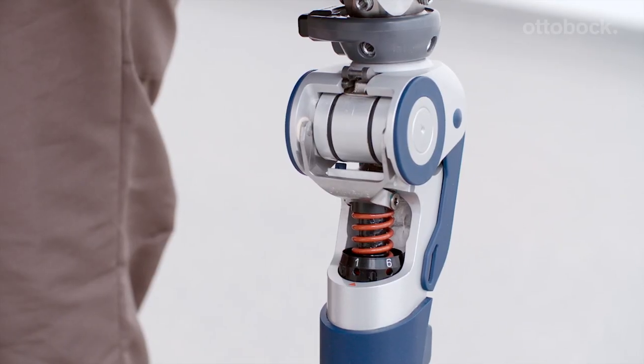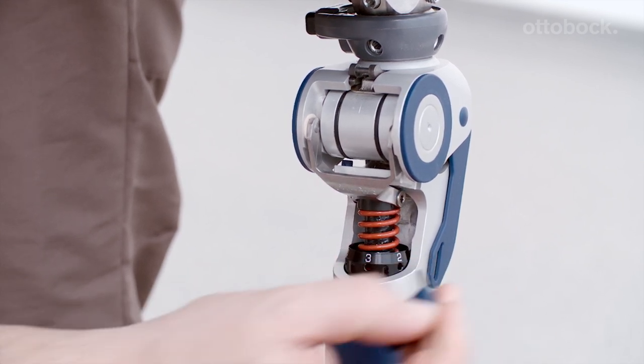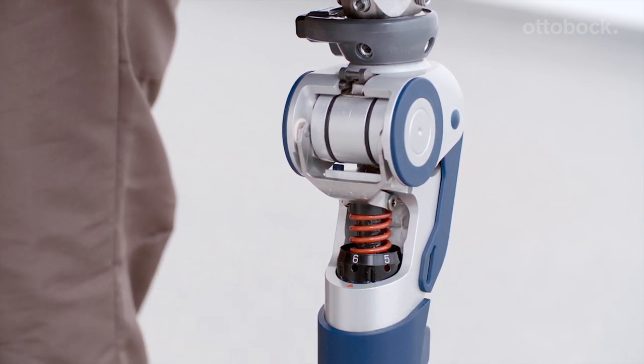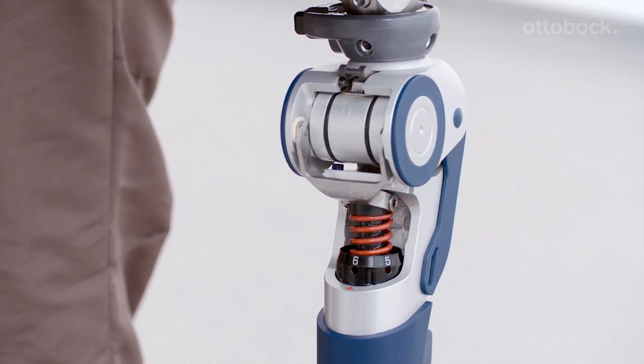To initiate the swing phase, the user relieves the load on the prosthesis, which deactivates the brake. The mechanical swing phase control of the 3R93 can be set to 6 levels by using the adjustment wrench to change the tension of the integrated spring extension assist.